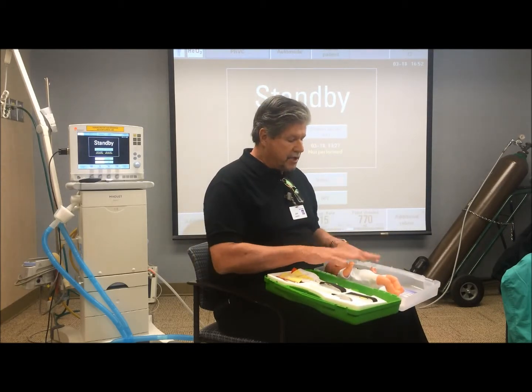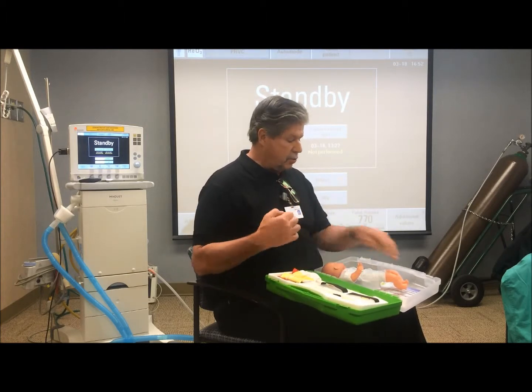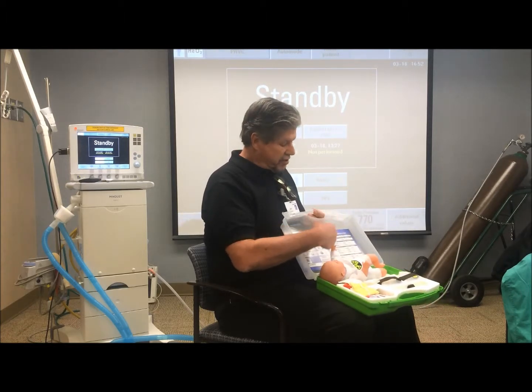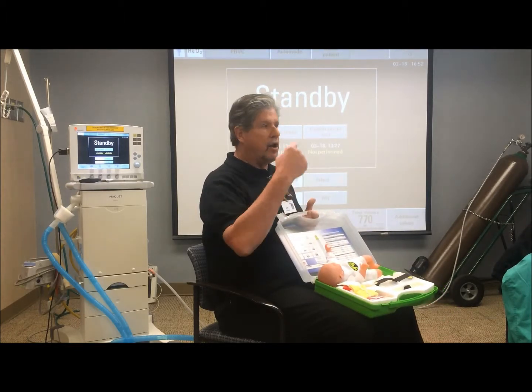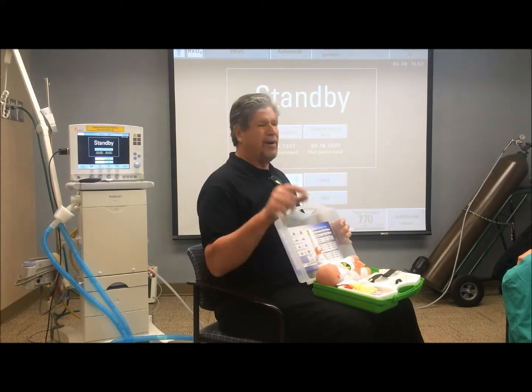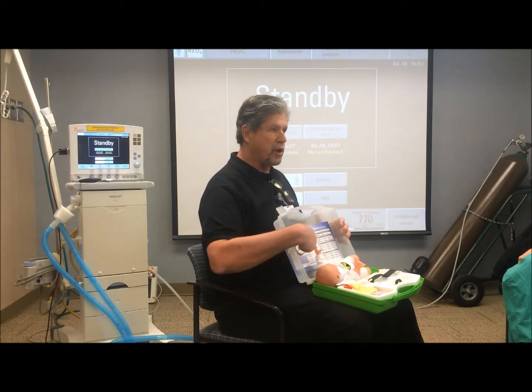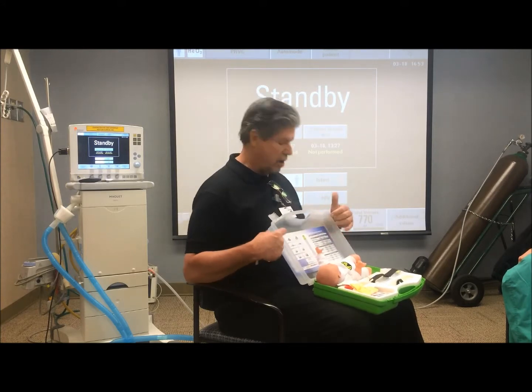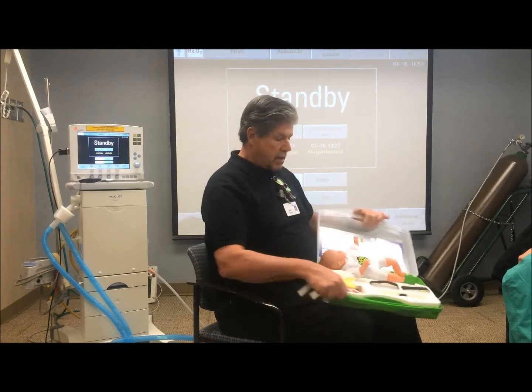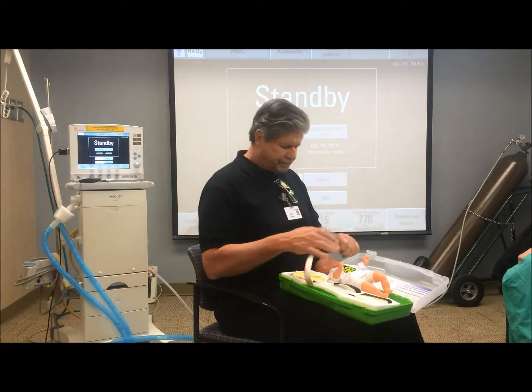So anyway, to use this interface, what you want to do first is, with the kits, when you order these, initially when we sent it to you the first time, we sent you a starter kit, and it had all the different sizes in it. And then after you do the starter kit, you say, well, we're never going to use this size or that size. So then the reorders would be whatever sizes you would use more consistently, the small or the big prongs or whatever prongs you would get. So all the ordering numbers are here, and that's how you would order them. I think you've placed reorders for these because you've used these on occasion.